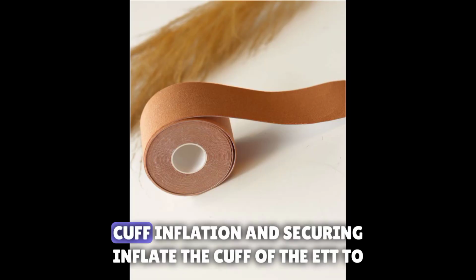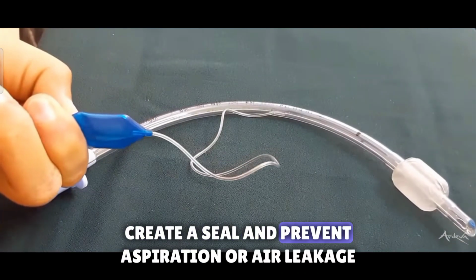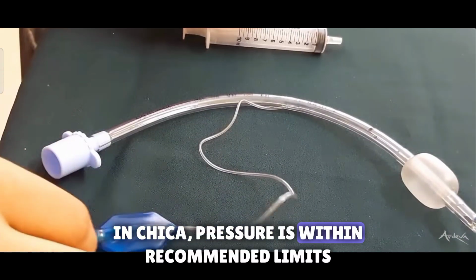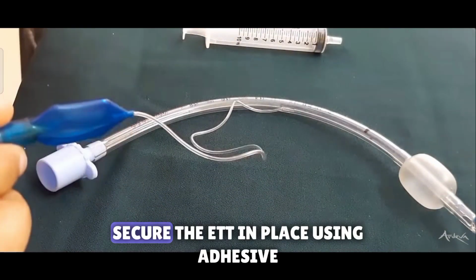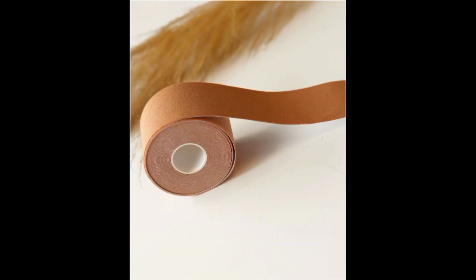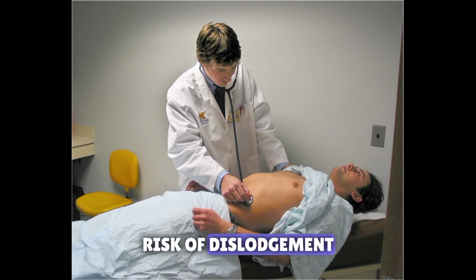4. Cuff inflation and securing. Inflate the cuff of the ETT to create a seal and prevent aspiration or air leakage. Ensure cuff pressure is within recommended limits. Secure the ETT in place using adhesive tape or tube holders. Verify that the tube is properly positioned and not at risk of dislodgement.